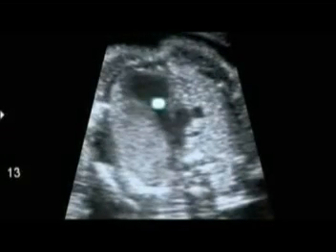Pulmonary outflow running into ductal arch, aortic arch.